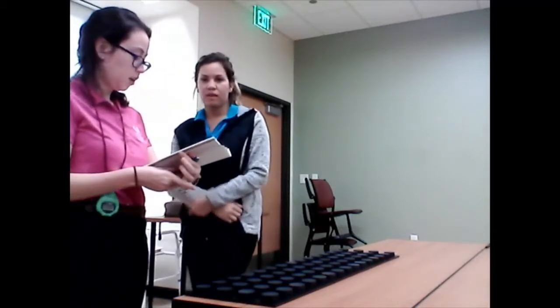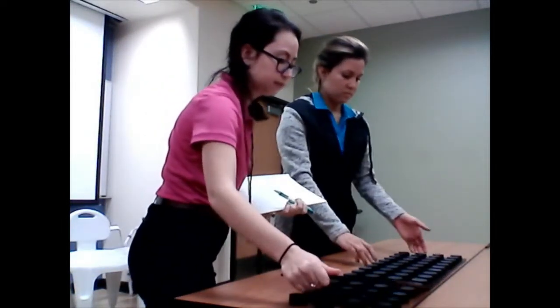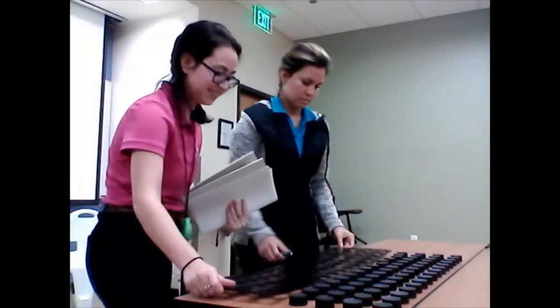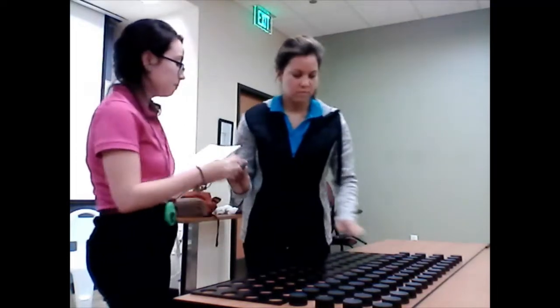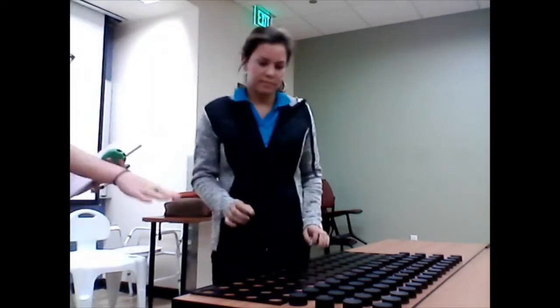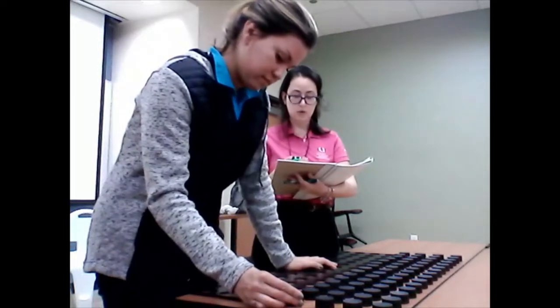Good job. We're going to do this one more time. We're just going to set this like this. You're going to do the same exact thing, but this time I want you to go as fast as you can. Remember that I am timing you. Please place your hand on the bottom peg, and when I say go, you'll begin again. 1, 2, 3, go.